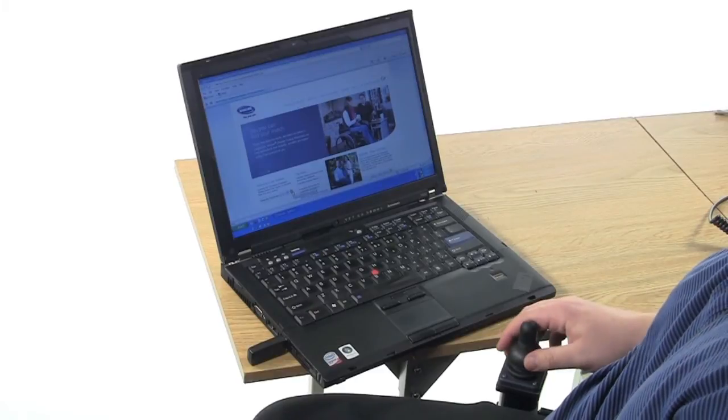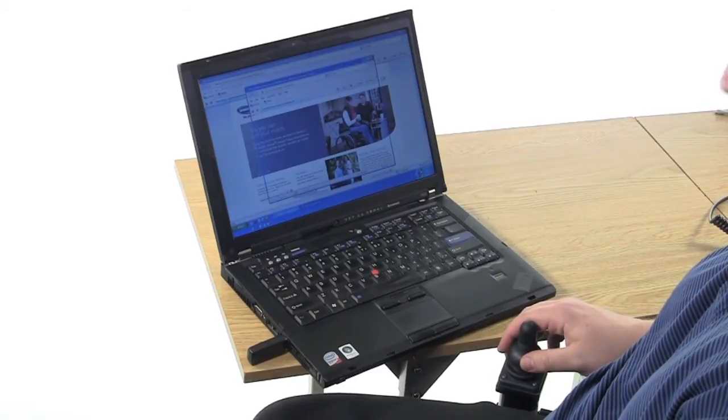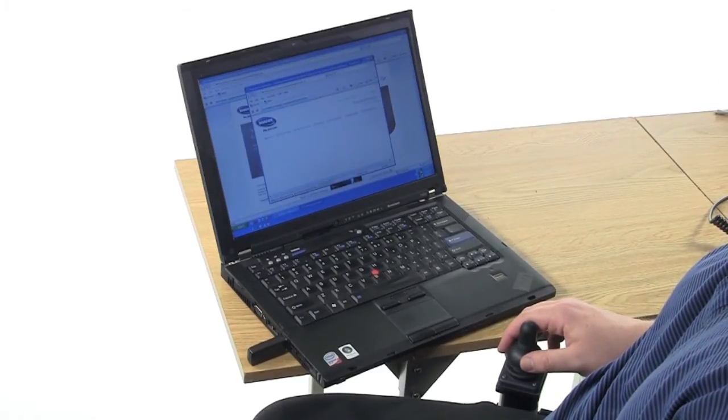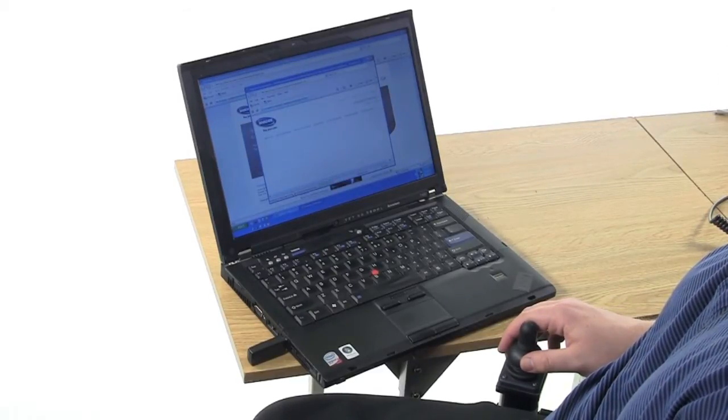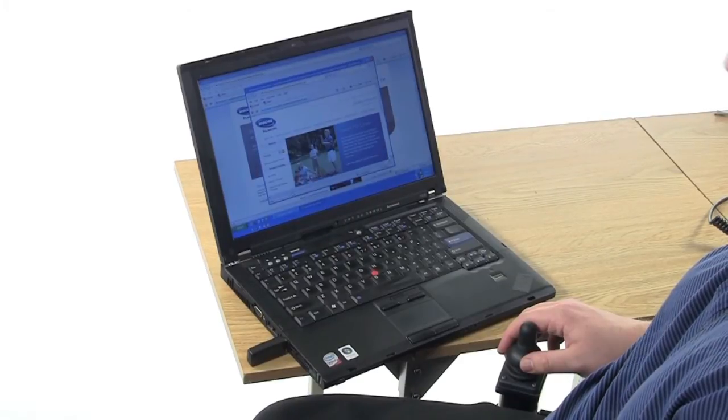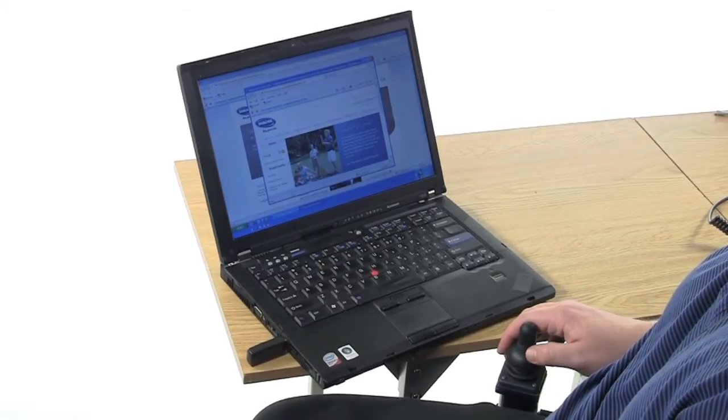With just one step with your handheld programmer, this will allow you to emulate the mouse through the driver control and this is only on Invacare wheelchairs.